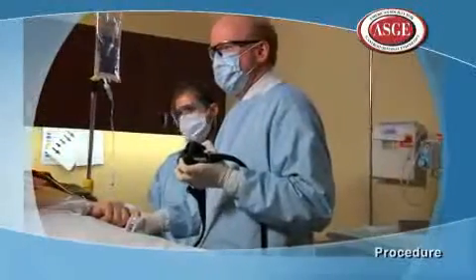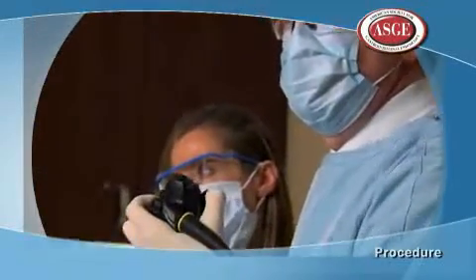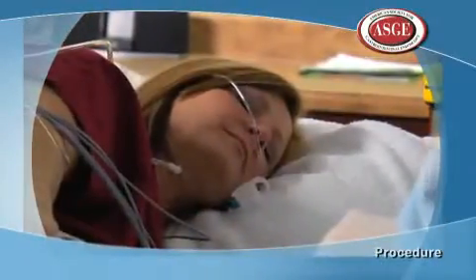The test itself is fairly quick. It's certainly less than an hour in the majority of cases. Sometimes if we have to do some more elaborate things, then it may add a little bit to the time of the case, but the patient's kept comfortable throughout.